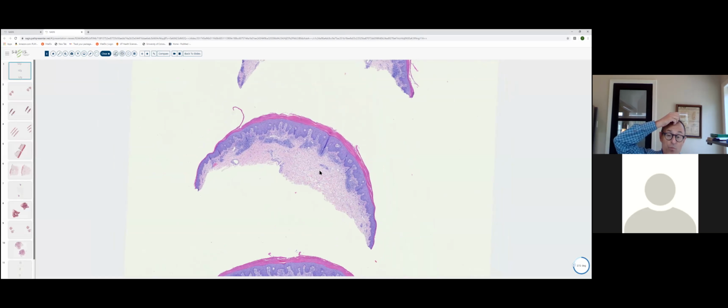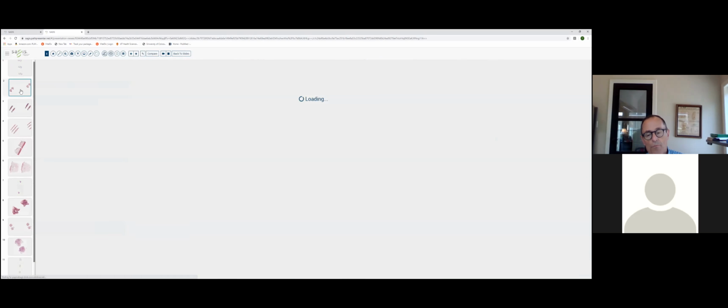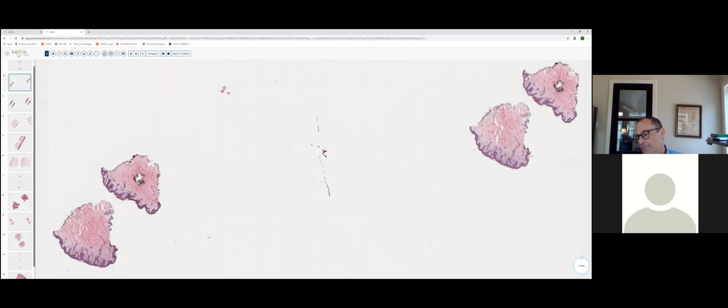A lot of times we will get biopsies with that clinical impression. The patients may come in with a widespread papulosquamous eruption of recent onset, and a lot of times the question is: is this guttate psoriasis or is this PR? Which is why I was asked to address this differential today. So let's go ahead and move on to slide 2.